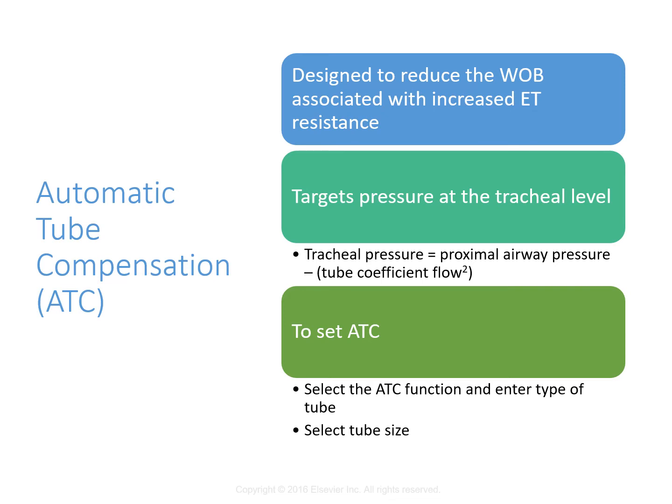So if the flow gets highly resistive, then it will adjust appropriately. What we do need to know is to make sure that we're monitoring the inspiratory and expiratory flow rates. And that's what that whole vent mode is supposed to do. It's going to use that closed loop control, right, where it calculates tracheal pressures. So usually you have to plug in the size of the tube here, and then it's going to continuously calculate the pressure drop across the tube when the breath is delivered.